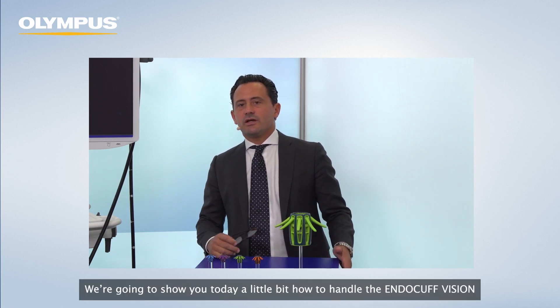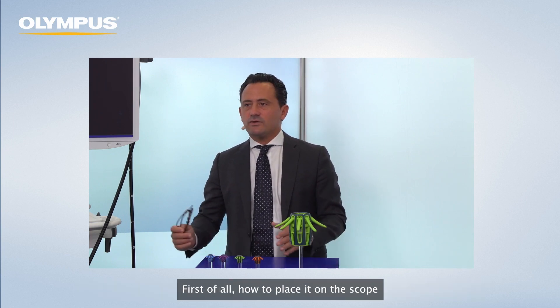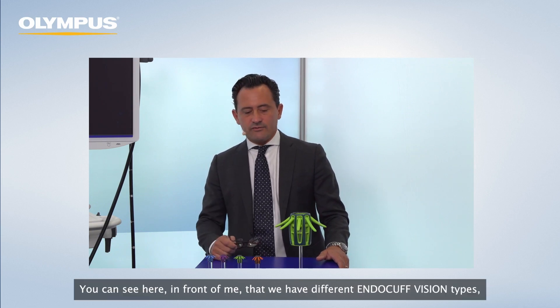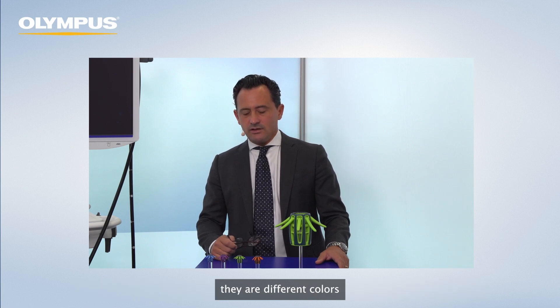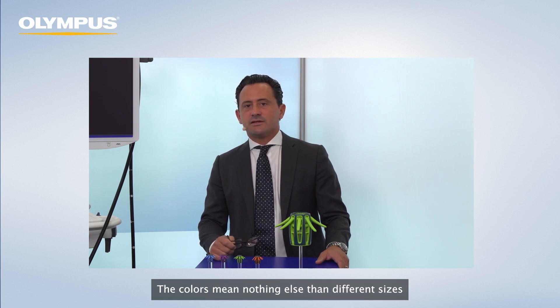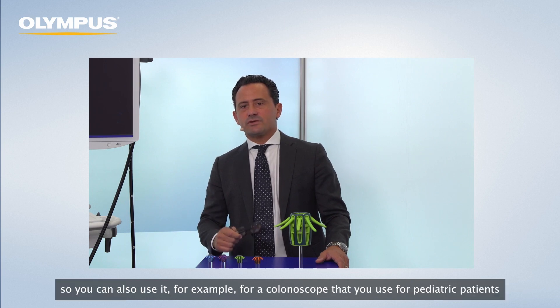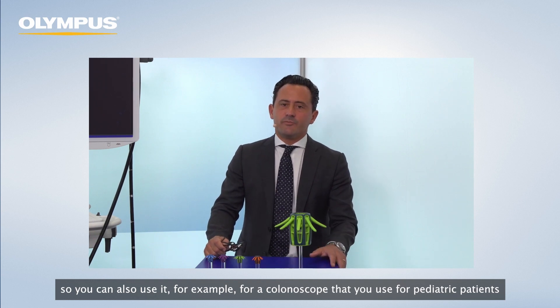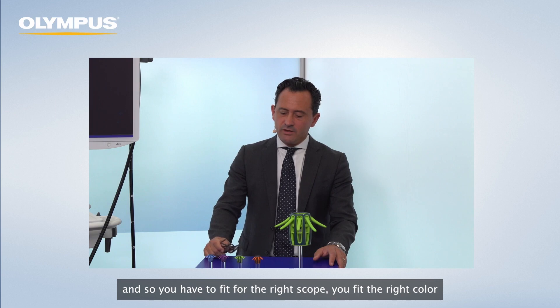We're going to show you today how to handle the Endocuff Vision — first, how to place it on the scope. You can see here in front of me that we have different Endocuff Vision types in different colors. The colors mean nothing else than different sizes, so you can place them on different types of colonoscopes. You can also use it for pediatric patients. You fit the right color for the right scope.